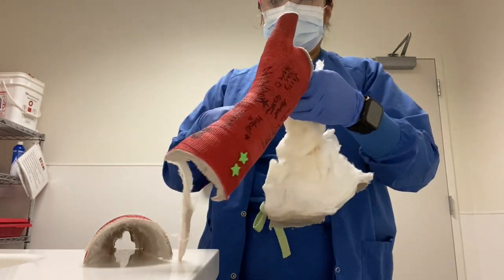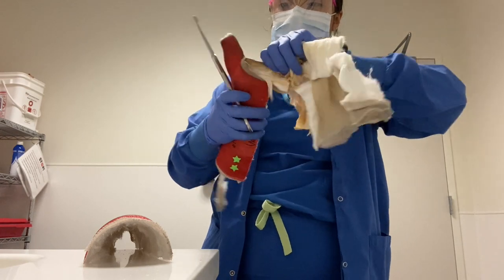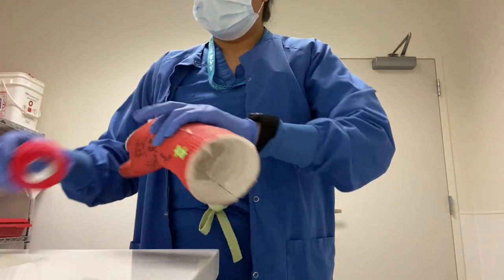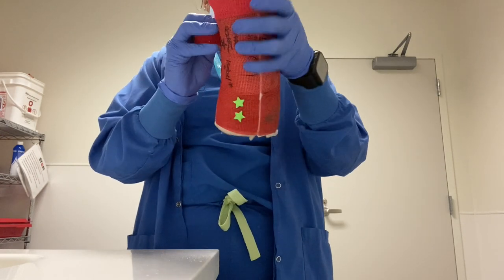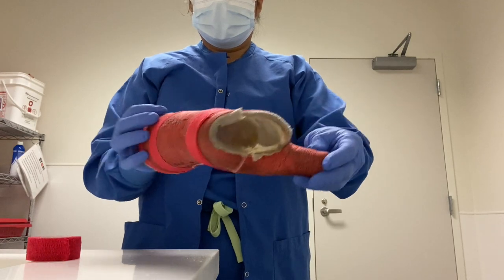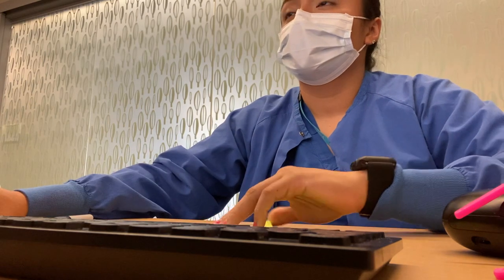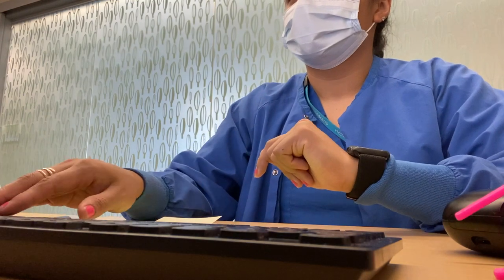Once we're done taking out all the padding, you just make sure you wrap it around with co-band, and this patient actually had to go back into a brace — thankfully they can take that off for showering. There's this phrase in the healthcare world: if you don't chart it, it wasn't done. So just a reminder to always chart when you're done with a patient.